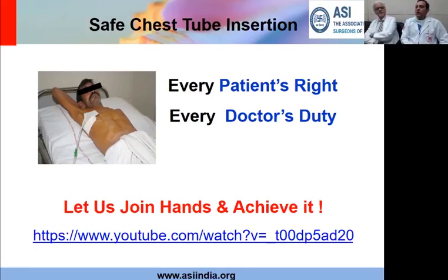Here also, prevention of tube blockage is the best option. Why does the tube get blocked? The tube gets blocked because there may be blood, and usually it gets blocked when it gets kinked. So the column is there and the blood clots inside. If the blood is draining freely, it will not get blocked. But sometimes there could be kinking, and the blood column remains inside and that gets blocked.